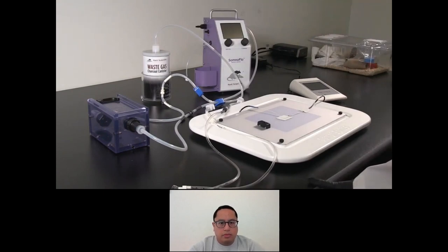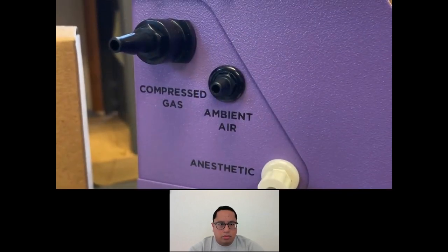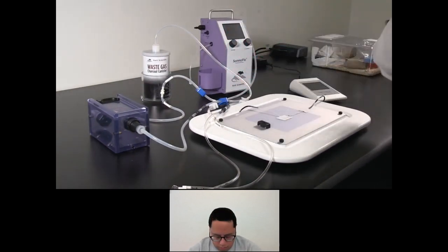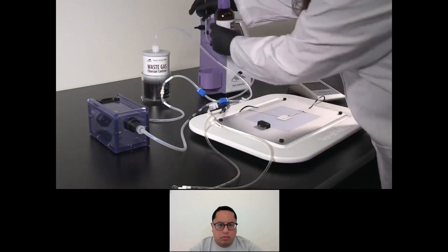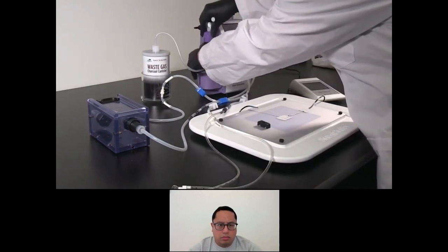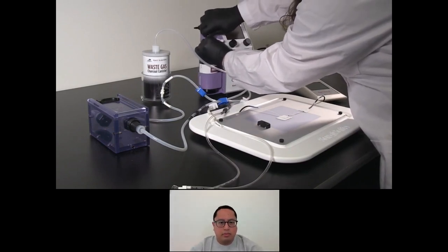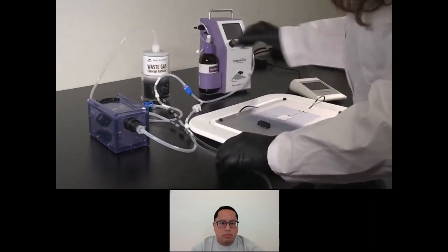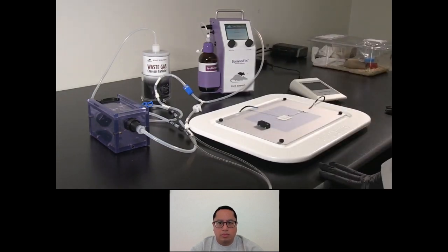Attach the charcoal canister using the charcoal canister tubing. The SomnoFlow can deliver anesthesia without the need for compressed gas. If you're using ambient air from the system's internal pump, leave the air inlet open. If you wish to use a compressed gas source, use the compressed gas assembly to connect a pressure regulated gas source to the SomnoFlow's compressed gas port. The inlet pressure should not exceed 15 psi. Connect the included bottle top adapter to a bottle of anesthetic, connect the delivery tubing to the bottle top adapter, and place the anesthetic bottle into the holder. Turn on the SomnoFlow to begin the automatic priming sequence; the system will draw anesthetic directly from the bottle and prepare the system for delivery.